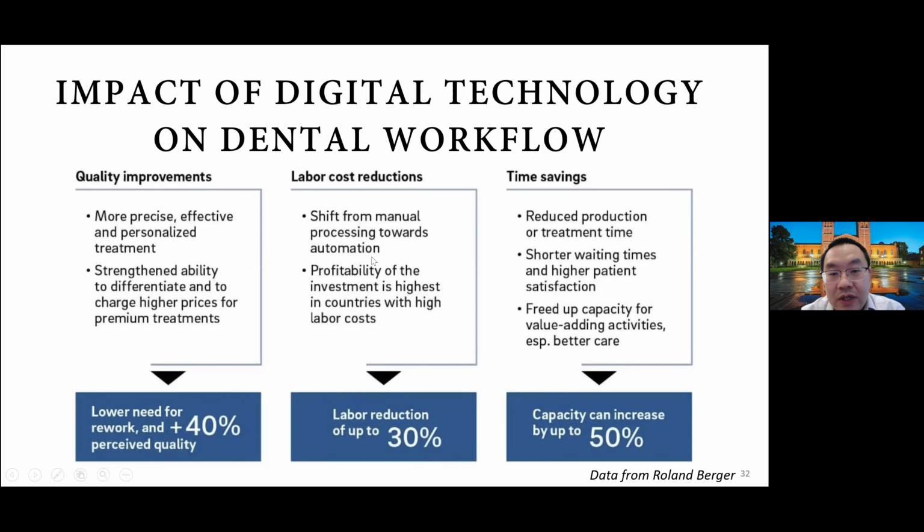Lab cost reductions are going to partially transfer to you as well, because the time cost of the lab reduces. Labs love it when you do a digital workflow, and eventually it's going to reflect in certain parts of your lab fees as well. Okay, time savings. I think that's a big part, because the reduced number of redos and reduced production time will increase patient satisfaction and also free up some of your chairside time to do other things and provide better care.